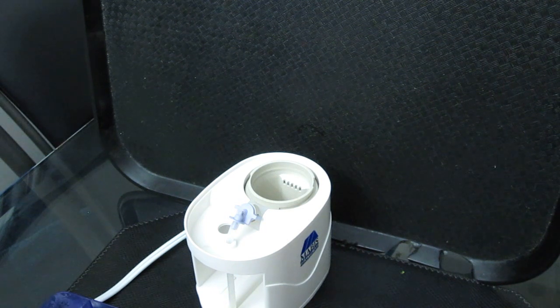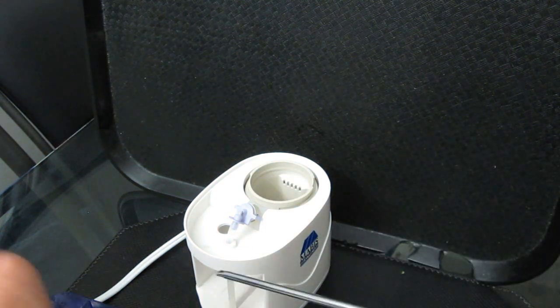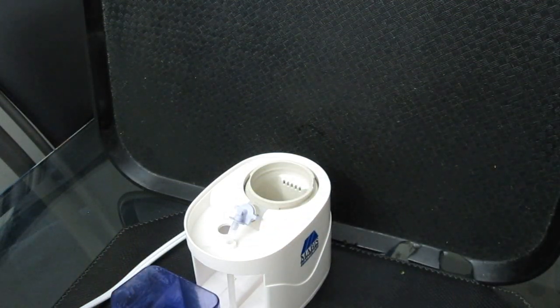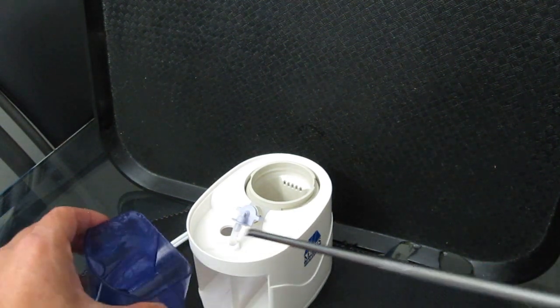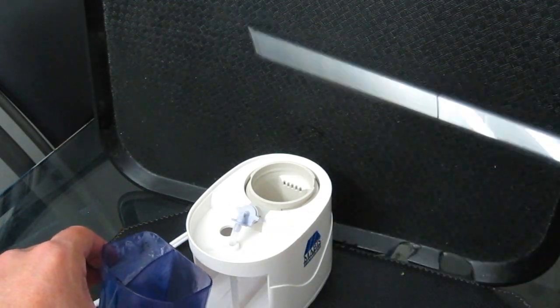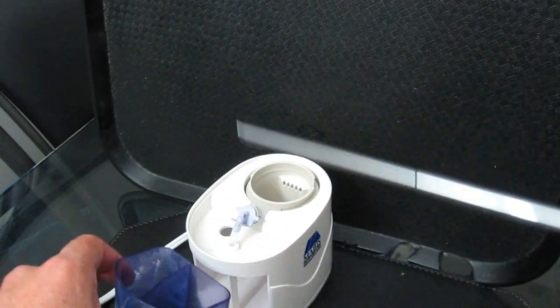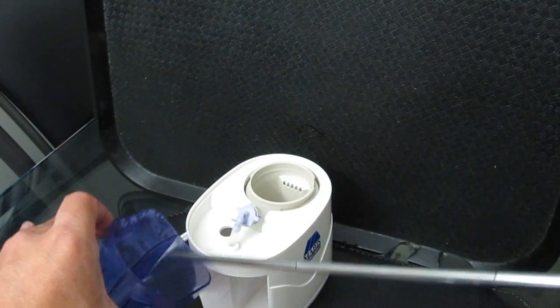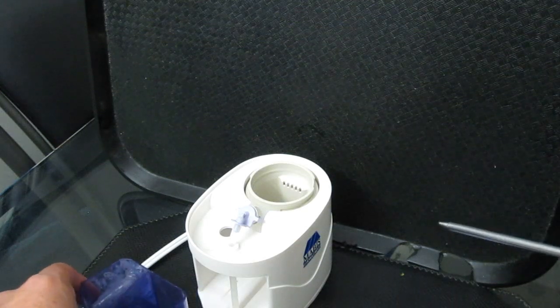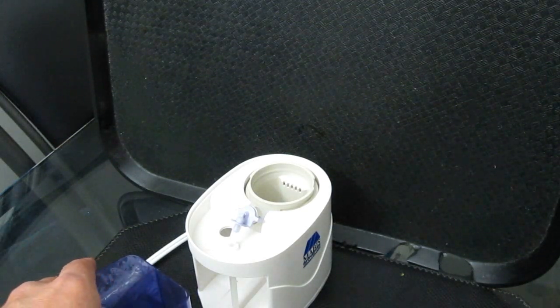Anyway, when it's working, it will draw water from your essential oil tank and this main reservoir tank. It combines it, comes here. That's why, as far as the essential oils, it's not very powerful at all. I tried to do higher ratios of oil to water mixtures in here, but that didn't help all that much, because if you don't put enough water in here, your total emission of steam, or the total output, isn't as great, because, as I said, it's drawing water from here and here. If you take away one source of water, you're left with, you guys get it. What else can I tell you?